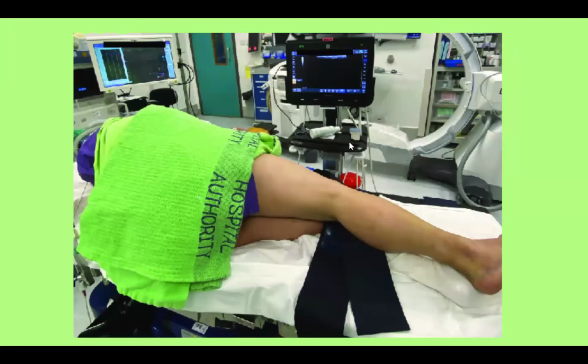This is the most convenient approach if you're able to position the patient like this. So you just have them lying on their side. If you do have the option of a pillow or some sort of support between the knees, just for comfort, that would be ideal.